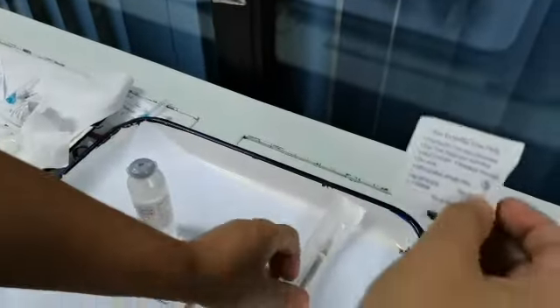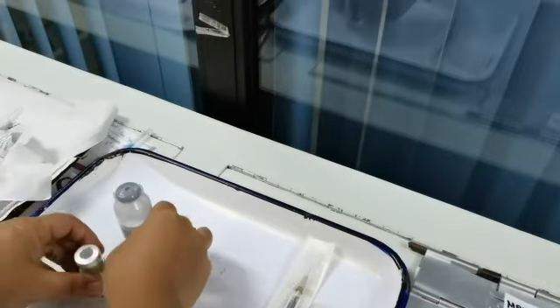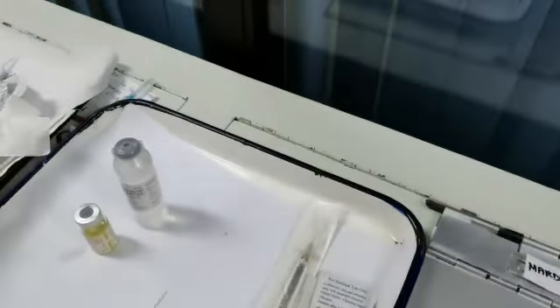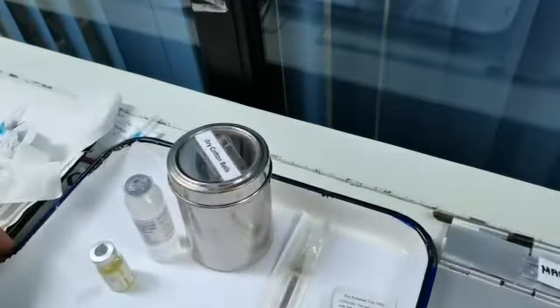So you are now ready in doing skin testing for the patient. So you prepare your alcohol swab, and then your dry cotton balls, then you go to the patient.